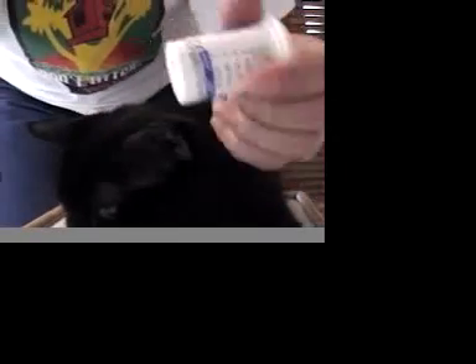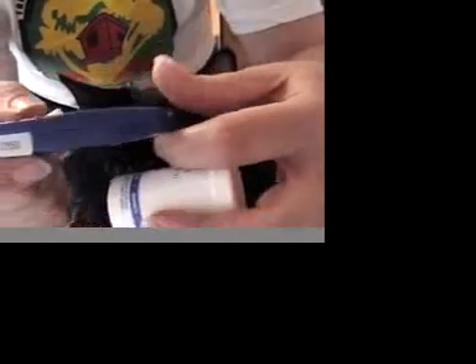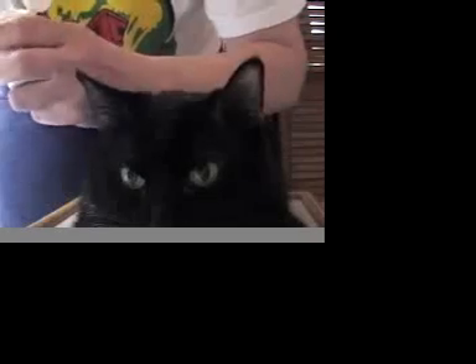You want to make sure your glucometer is coded to your strips. For the TrueTrack there is a little chip that goes in the meter, and you want the number on that chip to match the number on your vial of strips. It's also a good idea to check your strips on occasion using a control solution.